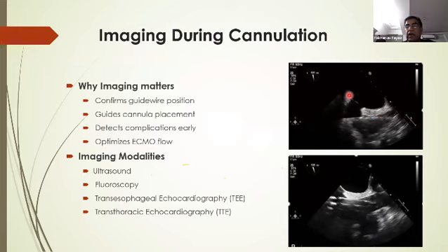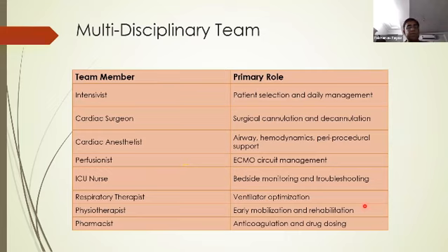This is the mid-esophageal bicaval view, and this is the left atrium, this is the right atrium, and this is the interatrial septum, and this is the wire which is inside the right atrium, and then this is the cannula. And we can exactly tell the operator where they should end up placing the cannula and how many centimeters they should withdraw, etc., under transesophageal guidance. So it's such a wonderful, sort of under-vision process.